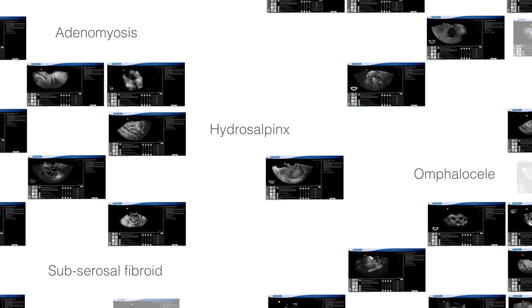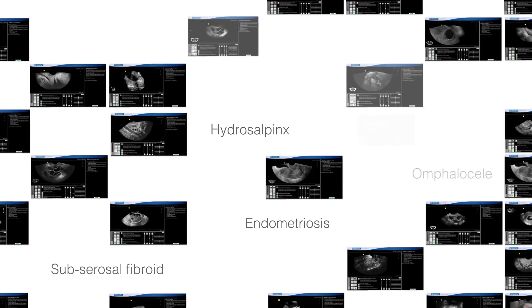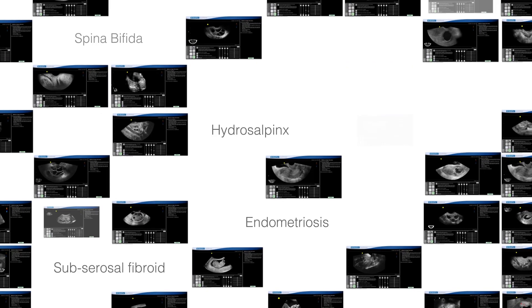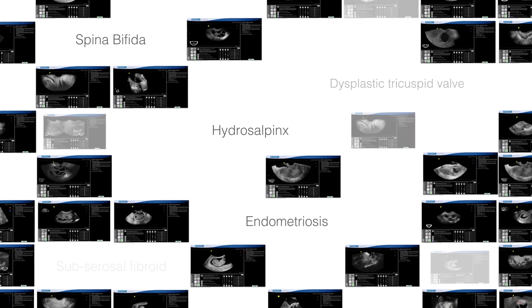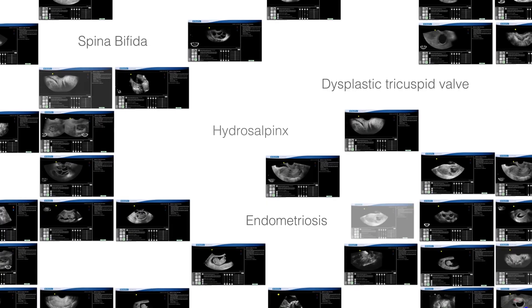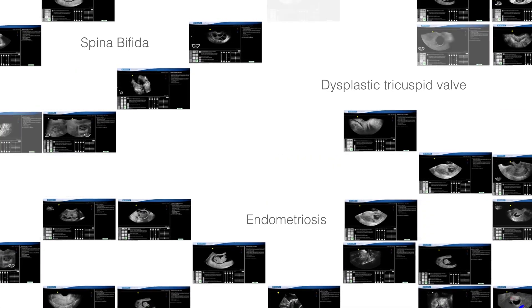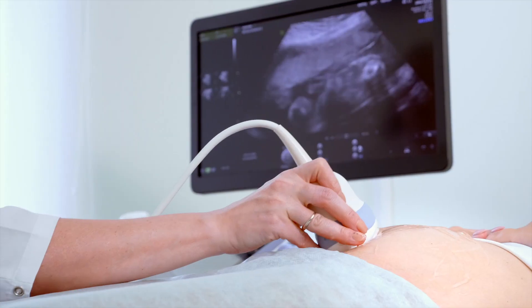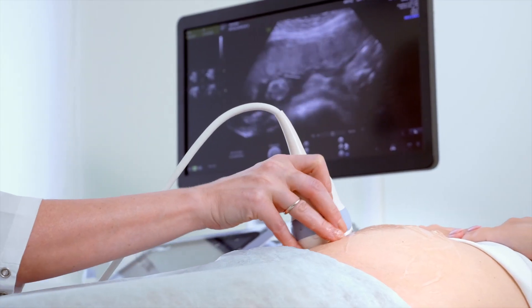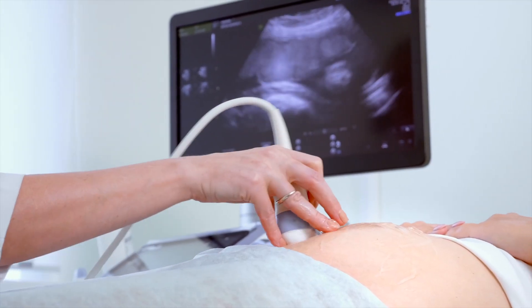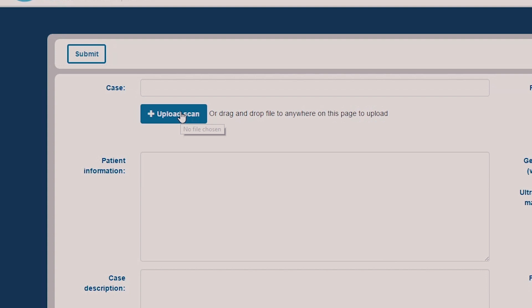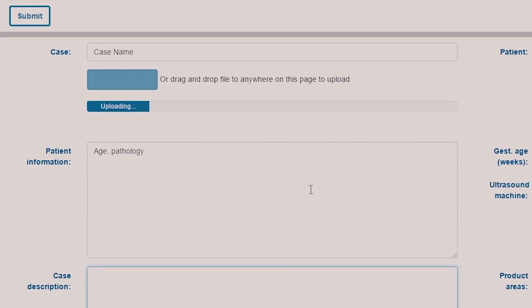Also included with ScanTrainer Cloud is the extensive case library, which contains over 1,000 real patient cases. New patient cases are continually added and tutors have the ability to upload their own scans with Case Generator.